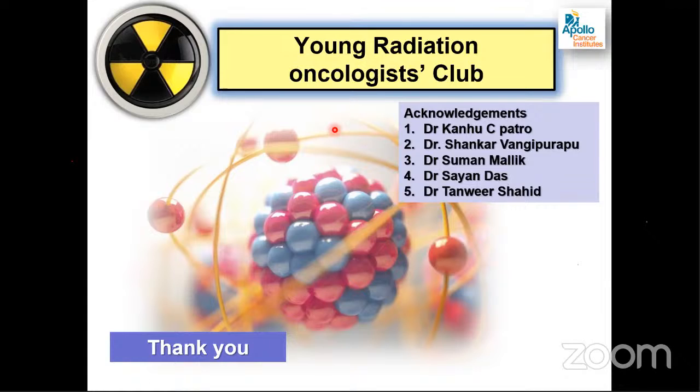In case of breath hold technique, why is radiation administered after a deep inspiration? Okay, at deep inspiration, the chest wall and heart separation increases because there is more air in the chest, so it expands. So the heart remains in its position and the chest wall goes out. So the distance between the chest wall and heart increases. So if you plan in this DIBH, deep inspiratory breath hold position, you can spare the heart. You can reduce the dose to the heart. For left-sided chest wall or left-sided breast irradiation, DIBH should be routinely done to reduce the dose to the heart.